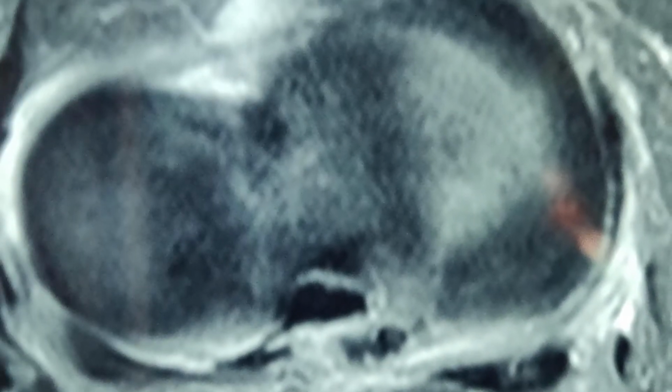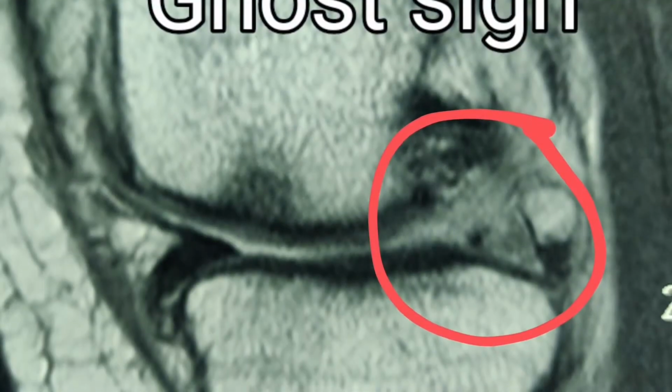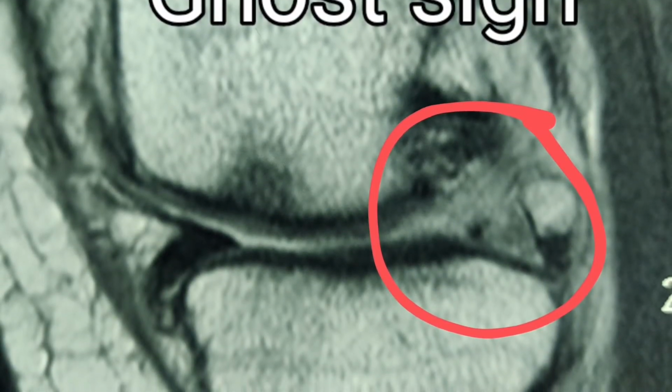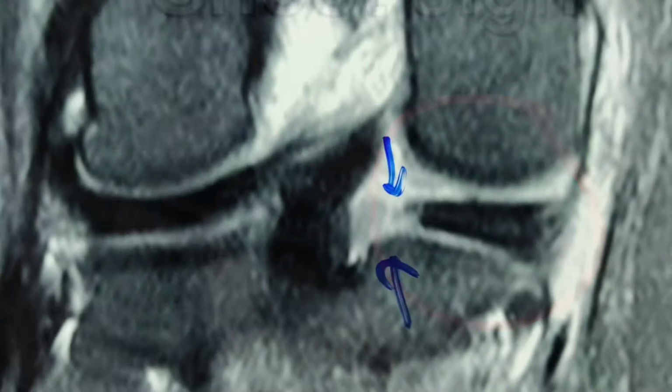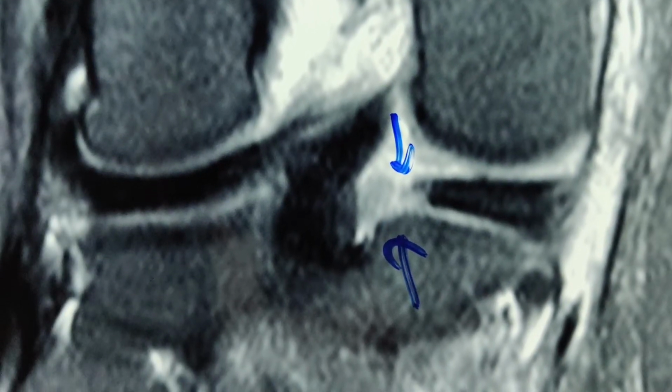Diagnosis of posterior medial meniscus root tear. As you can see on the axial images on the MRI, there is a ghost sign on the sagittal images of the MR, and you can see the posterior root tear there on the coronal images as well.